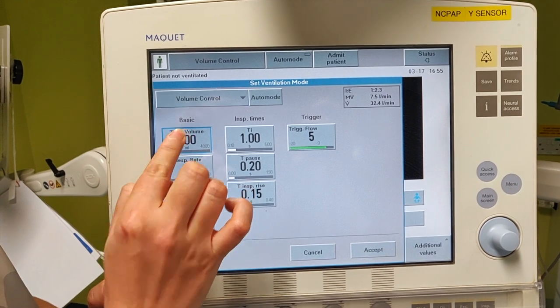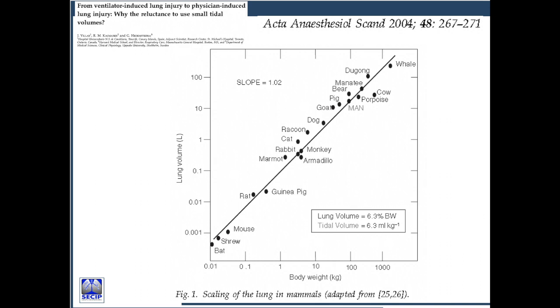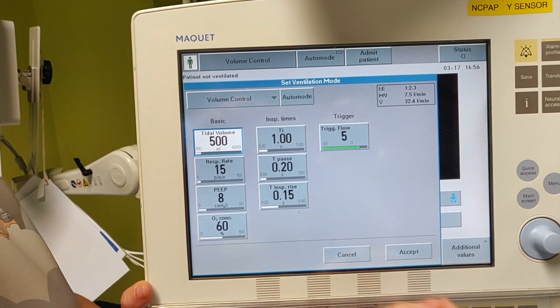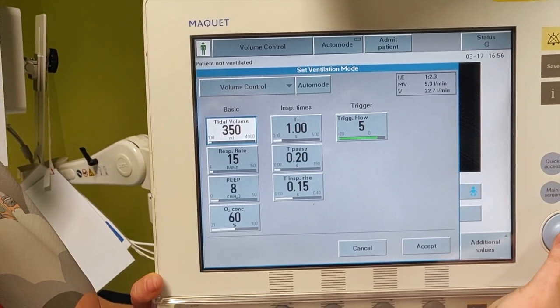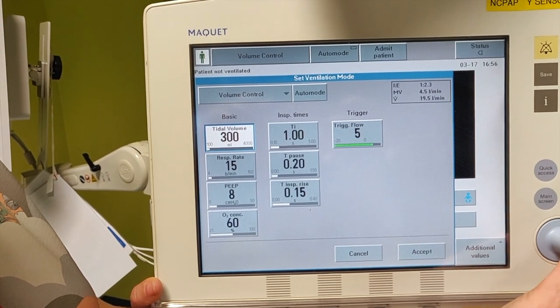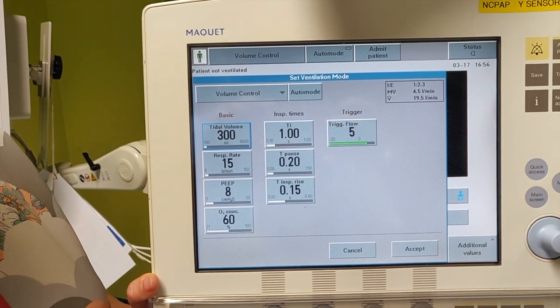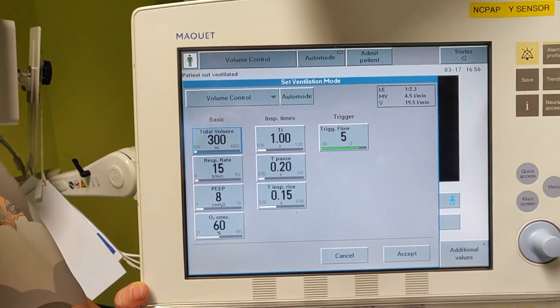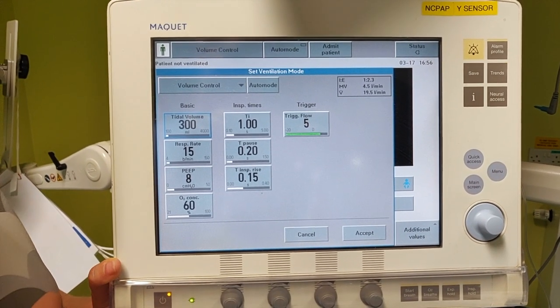We're going to set up a tidal volume of 6 mls per kilo of ideal body weight. Let's presume our patient is a 50 kilo teenager or young woman — this will be around 300 mls. There are several formulas to calculate ideal body weight, mainly based on height, age, and gender, and also estimates using ulnar length for younger adults. It is important that if our patient is overweight, we follow this, as lungs do not increase in size with body weight — you can see that by looking at the lung footprint on an x-ray. If we program per actual body weight, we will potentially be causing harm.